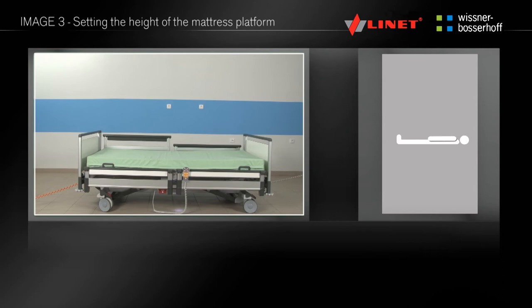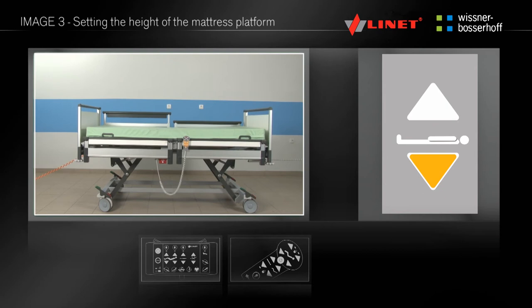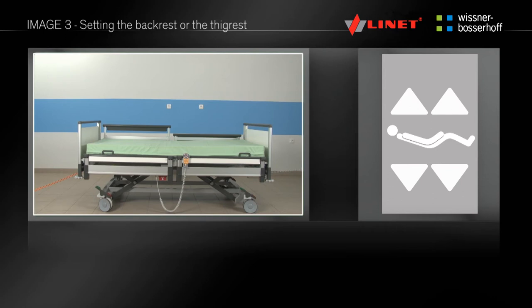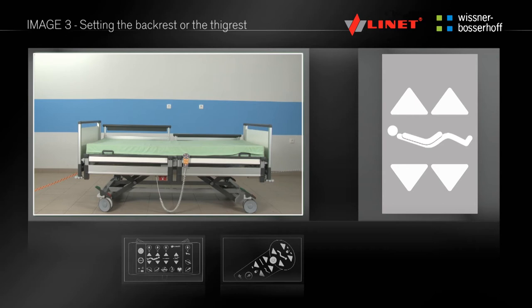To activate the function, press the go button. By pressing and holding the appropriate button, you can set the desired height, angle of the backrest or thigh rest. You can operate this function on the supervisor control panel and the handset.